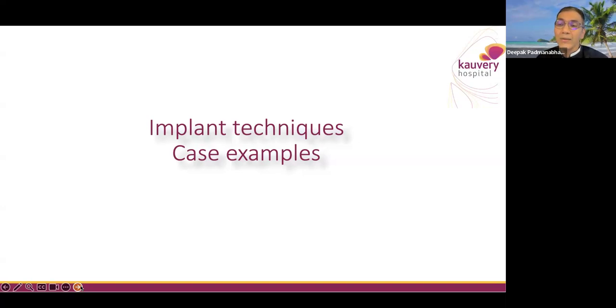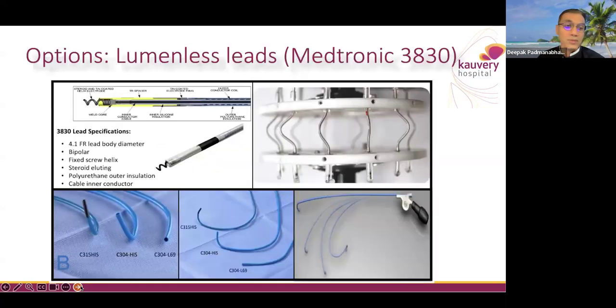So to me, that aspect of anatomy was very fascinating and probably has led to an advantageous situation for the left bundle pacing enthusiasts as compared to those on the His bundle. Go for it. Just wanted to make that point, but thank you.